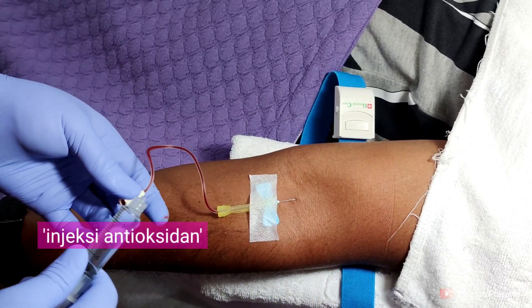Jadi, di tiga tindakan tadi saya kerjakan sekaligus dalam satu waktu — pengambilan dua kali untuk PRP dan satu untuk antioksidan, saya kerjakan sekaligus.